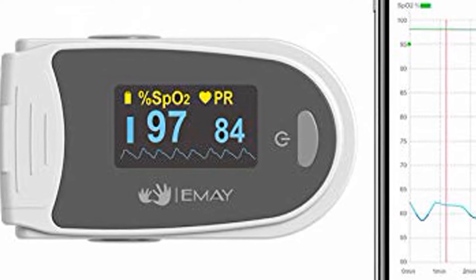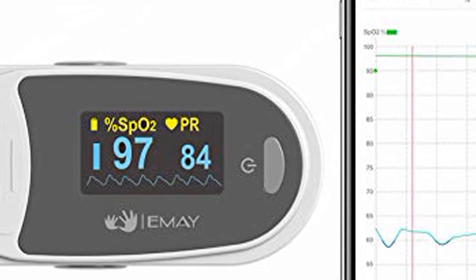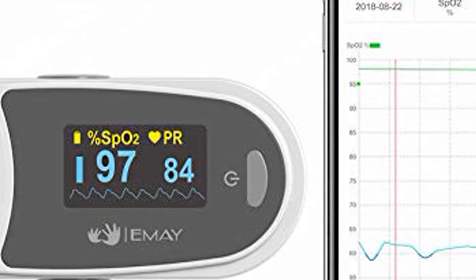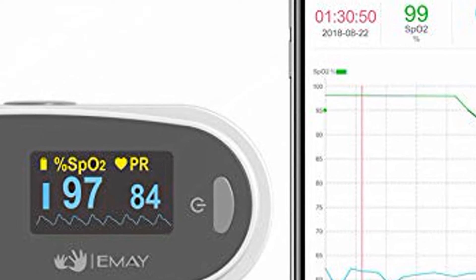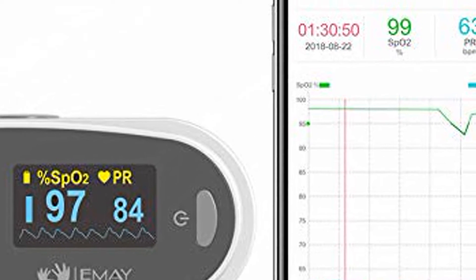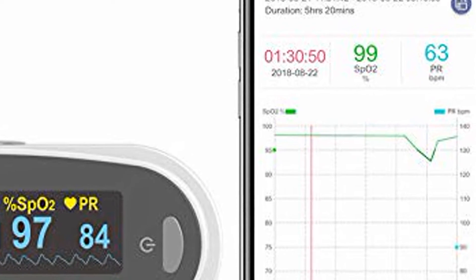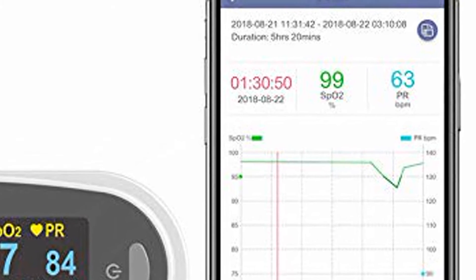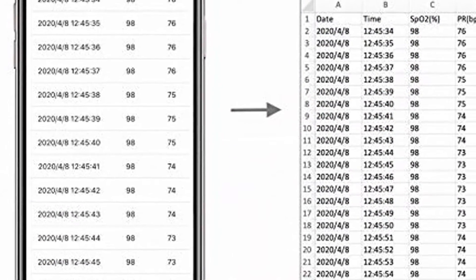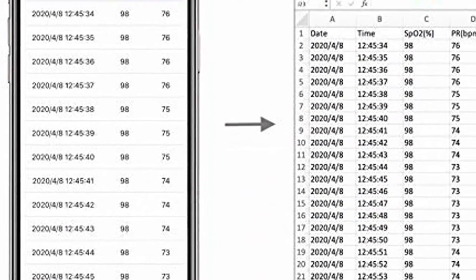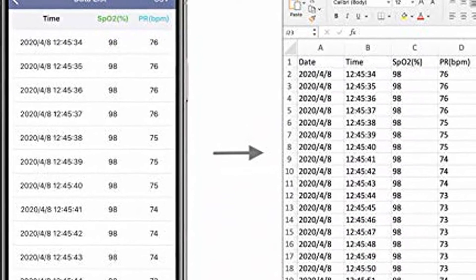MA Sleep Oxygen Monitor with app for iPhone and Android — track overnight and continuous blood oxygen saturation level and heart rate with professional report. Memory stores data up to 40 hours with a 40-hour built-in memory.